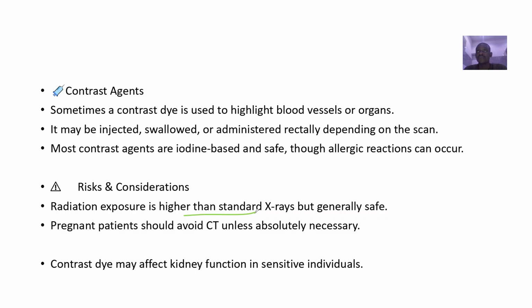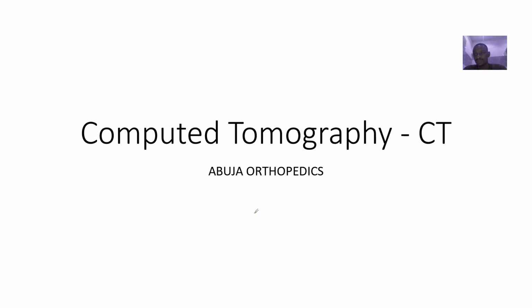Then if you are giving contrast, you should make sure that the person's kidney is functioning very well. Do you understand? If the kidney is not functioning very well to be able to excrete the contrast, you can have a backlog of the contrast in the body of the patient. Okay, so that's it for CT scan.